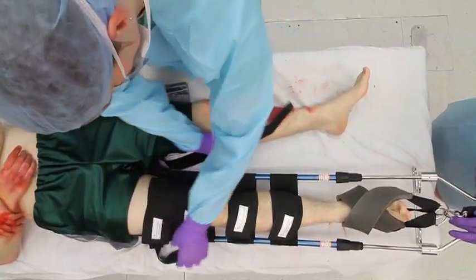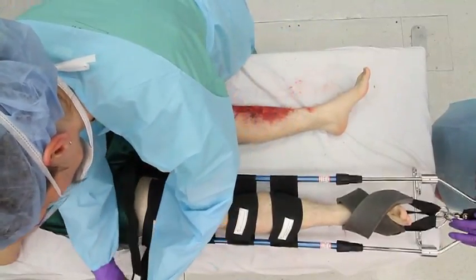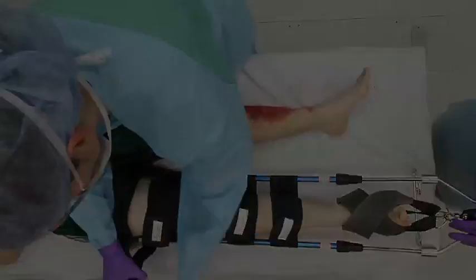Frequently re-evaluate and document the neurovascular status of the extremity after every manipulation.